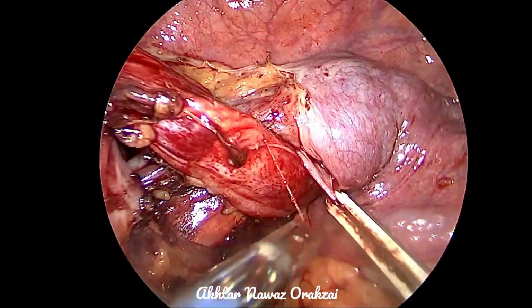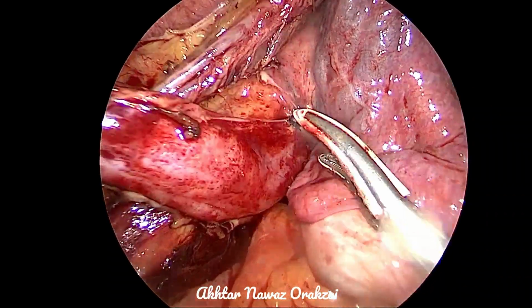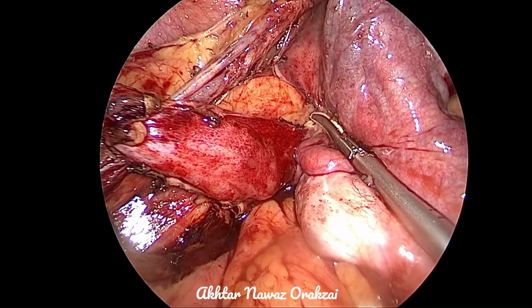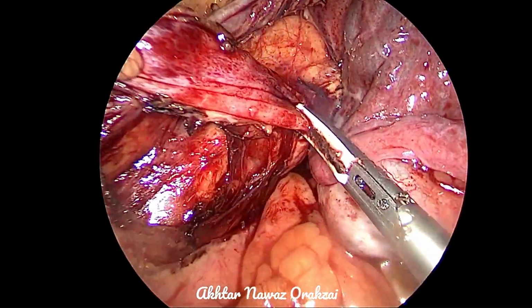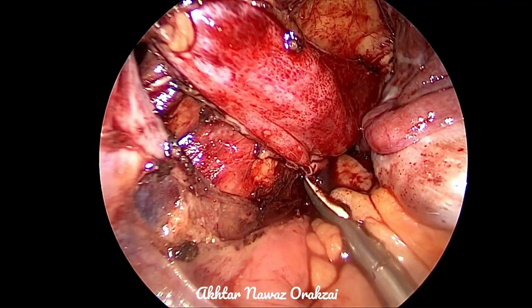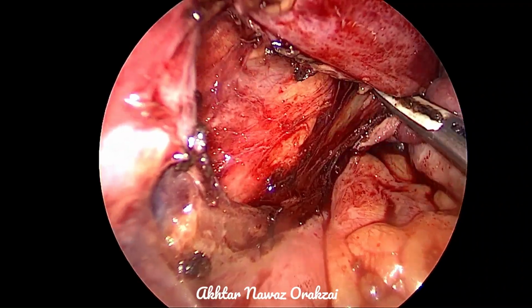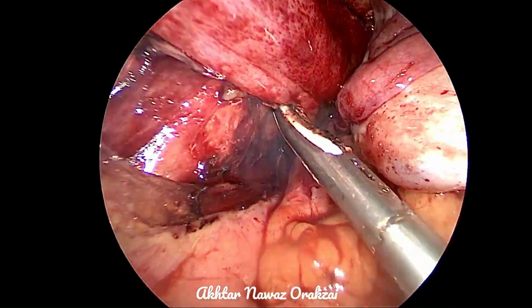Mobilization is extremely important because the anastomosis between the ureter and the bladder has to be totally without any tension. A slight bit of tension will lead to ischemia and of course again stenosis and stricturing of the ureterovesical anastomosis.